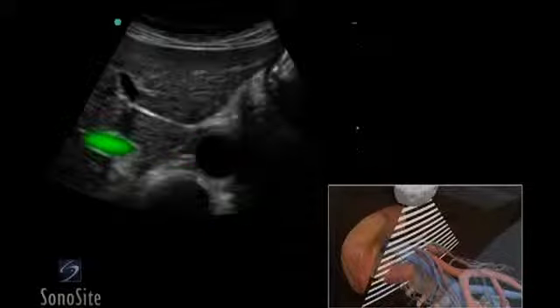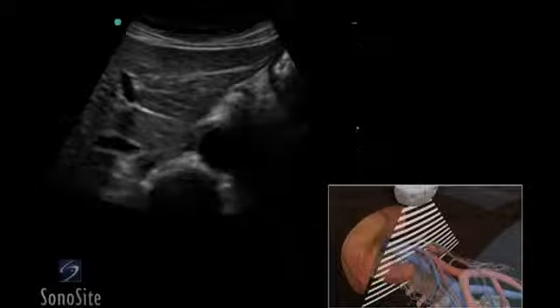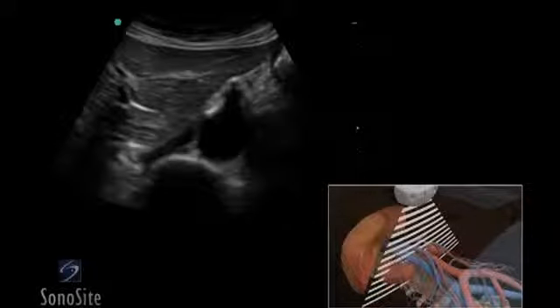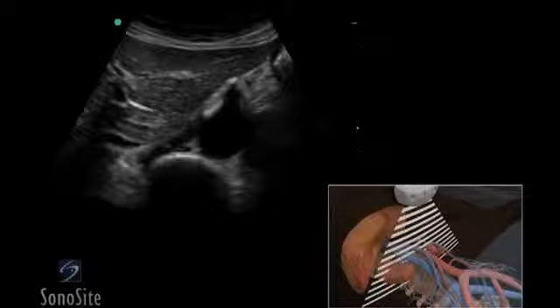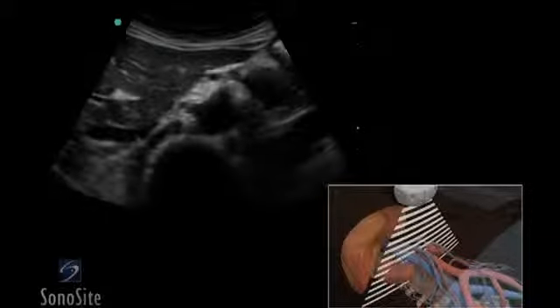The vena cava is an oval structure immediately to the left of the aorta on the screen, which changes in caliber with compression or deep inspiration.